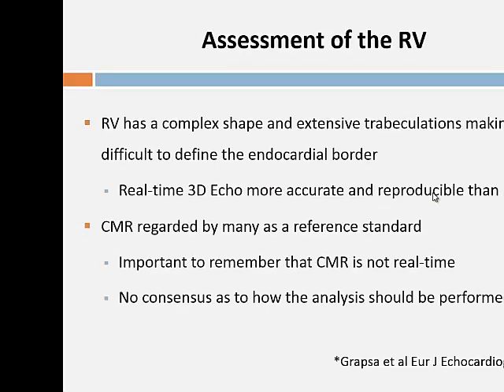So MRI, as I've said, not everybody uses MRI, but MRI can be very useful in the assessment of the right ventricle. We can also assess flows. So one of the ways that you can assess to see if there's a shunt, remember some of these cases with pulmonary arterial hypertension will have shunts as the mechanism behind the pulmonary arterial hypertension. Not just sinus venosus defect, but things like that. And you can estimate the QP-QS, okay? So you can measure the flow in the aorta, you can measure the flow in the pulmonary arteries, either the main or indeed the left and the right.